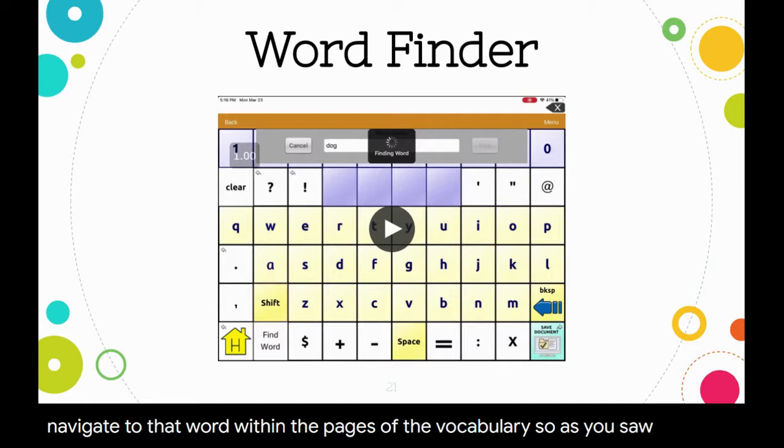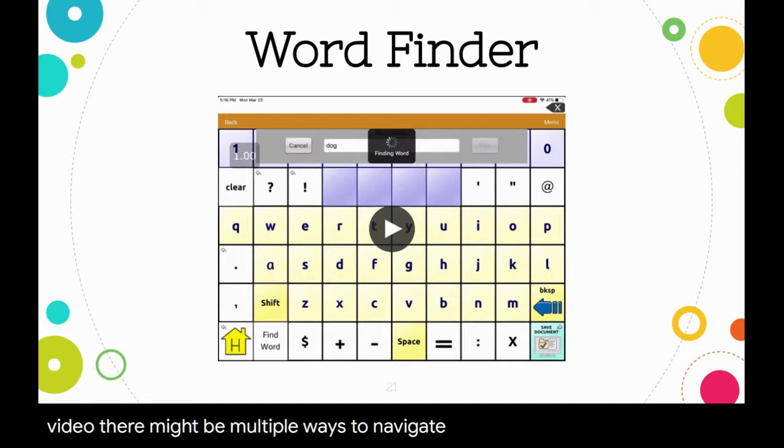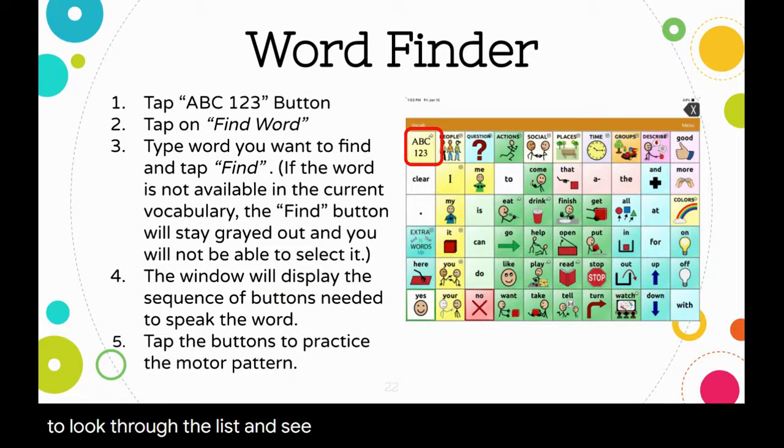So as you saw in the video, there might be multiple ways to navigate to the word you want. The first choice they offer you is usually the quickest, but sometimes you might just want to look through the list and see. This slide has directions for using the Word Finder feature with the steps written out in case you prefer that.